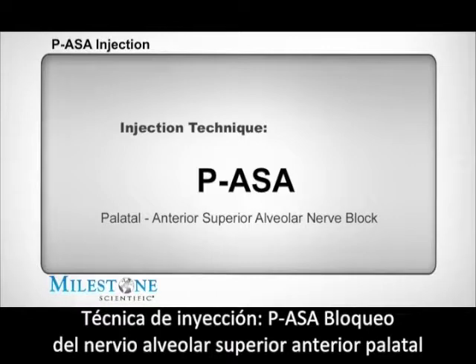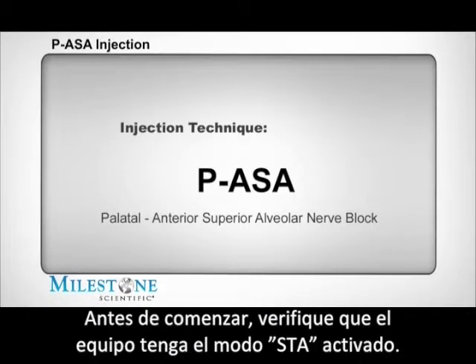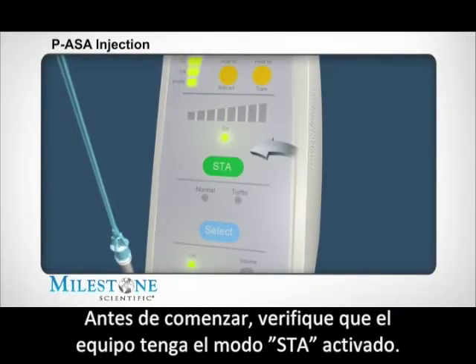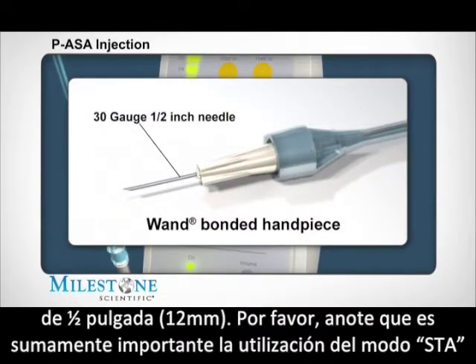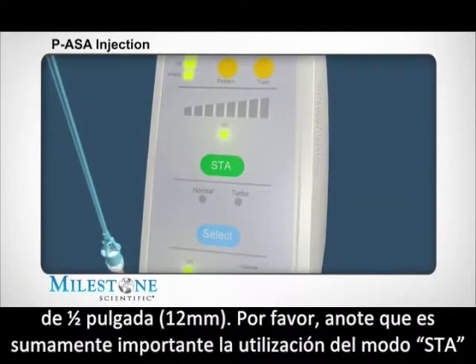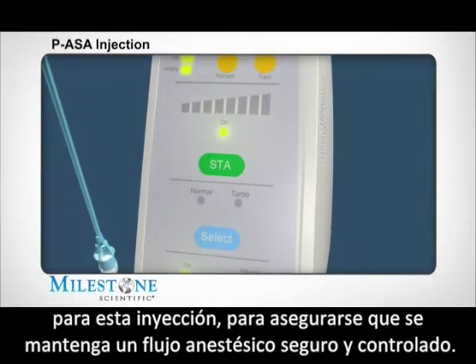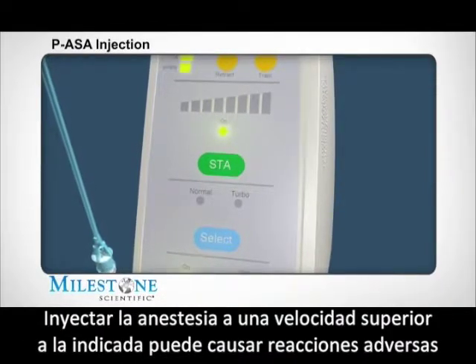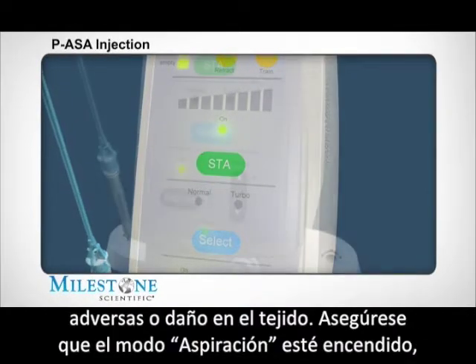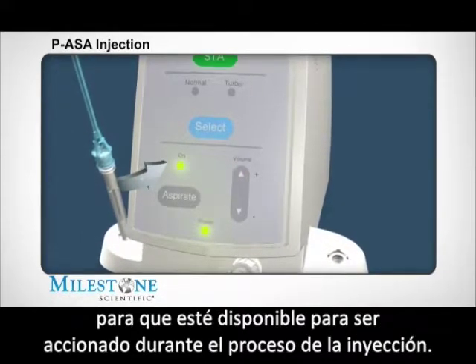Injection technique: PASA or palatal approach, anterior superior alveolar nerve block. Before you begin, verify the STA system instrument is set to the STA mode. It's recommended that you use the 30-gauge, half-inch bonded STA wand handpiece for this injection. It's critical to use the STA mode to ensure that a safe and controlled single flow rate is maintained throughout this injection. Delivering the anesthetic at a faster rate can result in adverse tissue reactions and/or tissue damage. Make certain the aspiration feature is on, as an aspiration test may be performed during anesthetic delivery.